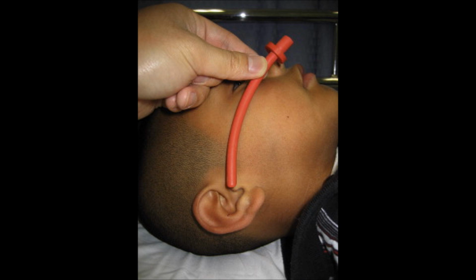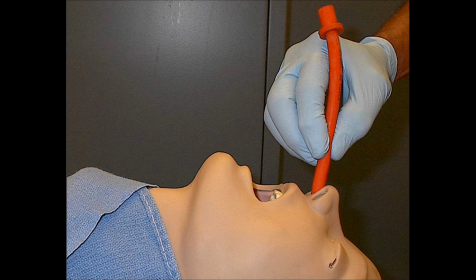So before inserting the NPA, of course you have to look for the proper size. You have to compare the outer circumference of the NPA with the inner aperture of the nares. The NPA should not be so large that it causes sustained blanching of the nostrils. In a quick assessment, you can use the diameter of the patient's smallest finger as a guide to selecting the proper size.